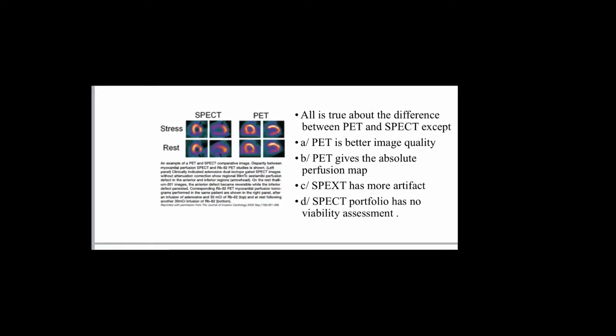The diagnostic accuracy of viability assessment in CMR corresponds so well with the histopathology itself. So the diagnostic accuracy is unbeaten by the rest. Besides, it's non-radiation. So if you have CMR, go for it. If you don't, then expect PET or echo, or even cardiac CT might be used.